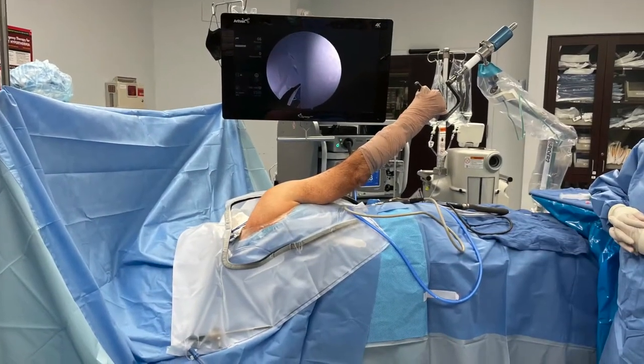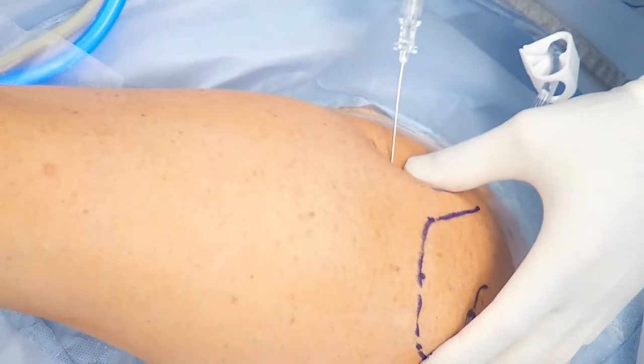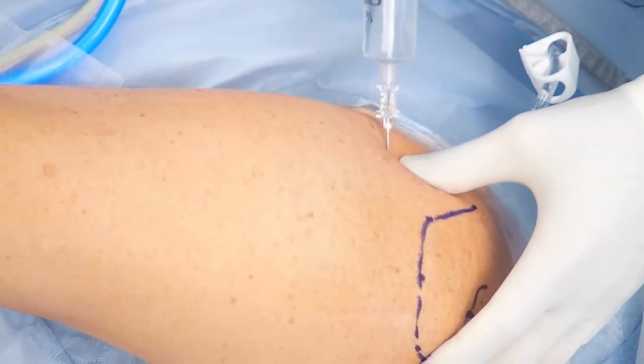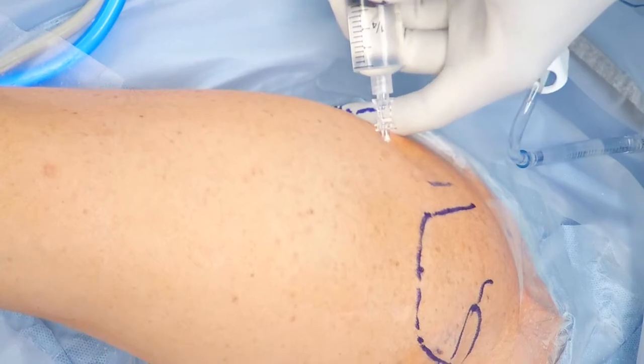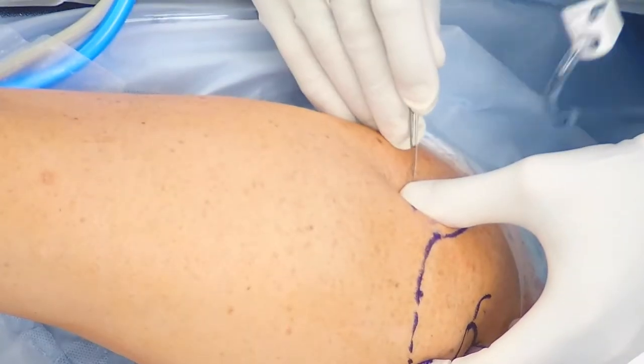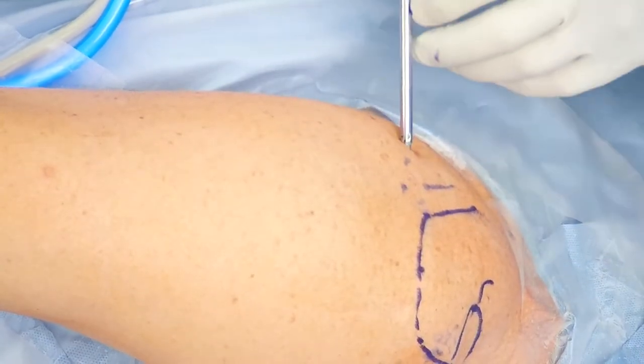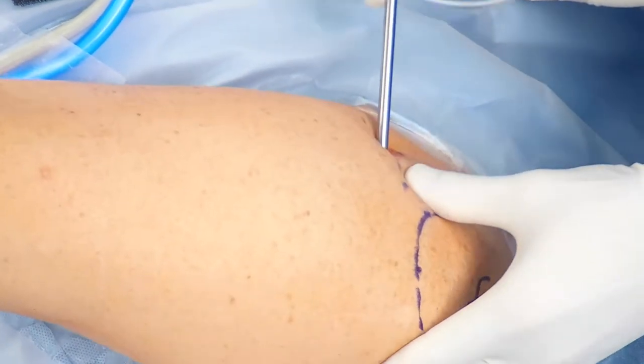Here is the positioning of the patient, a left lateral decubitus with traction on the arm at 60 degrees. Posteriorly, we will insufflate the joint with lactated ringers, allowing us to find the glenohumeral joint and then make the posterior portal and enter with a standard four-millimeter shoulder arthroscope.